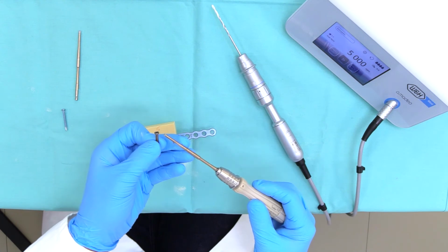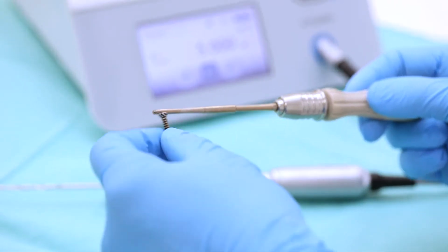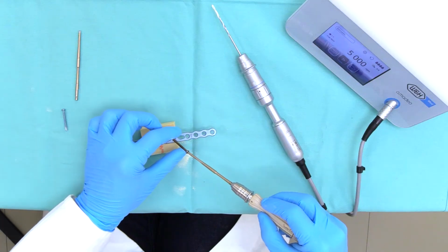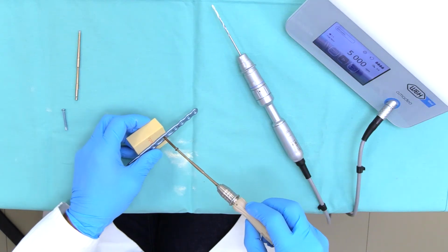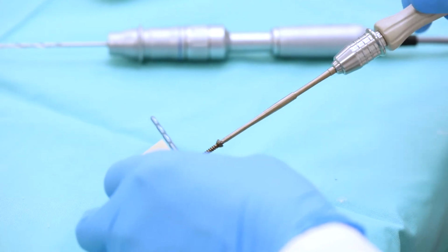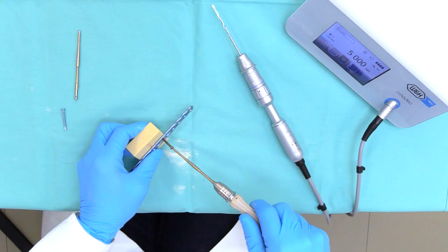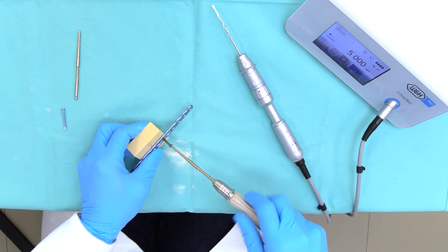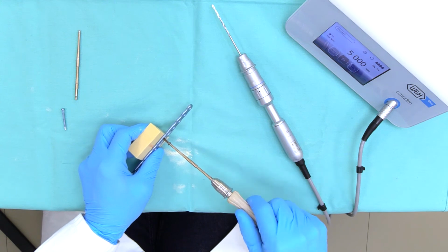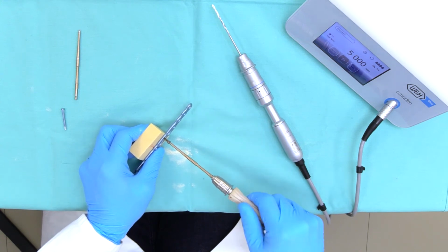The angular stable screw is fixed in the plate. It is essential not to over-tighten the screw in the plate.